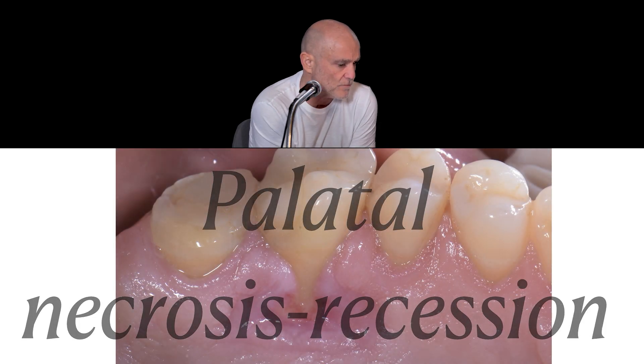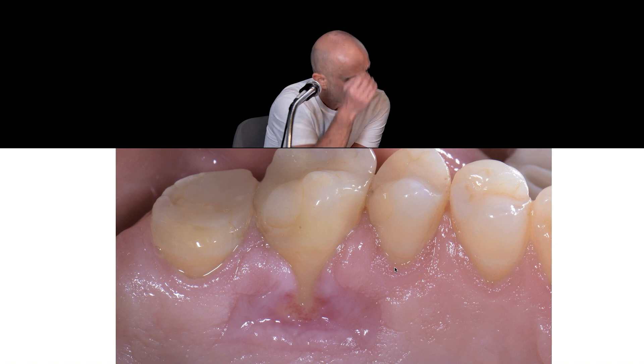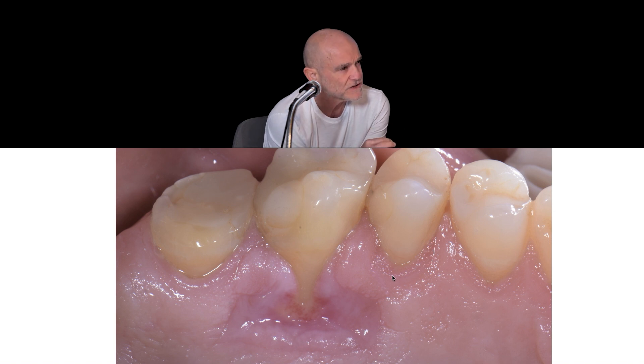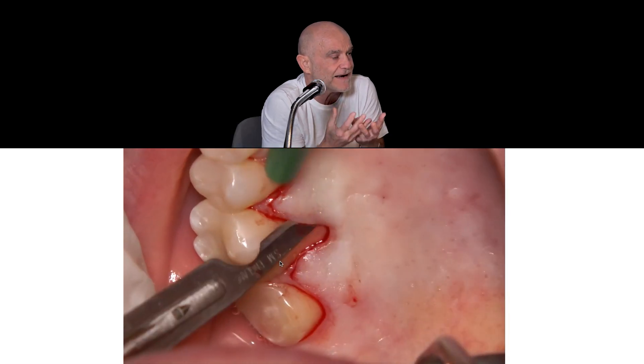When we make our incision, we always have to probe the apical soft tissue from the palatine side and leave one millimeter of adherent gingiva — which means beyond probing, leave one millimeter more gingiva on the palatine flap.